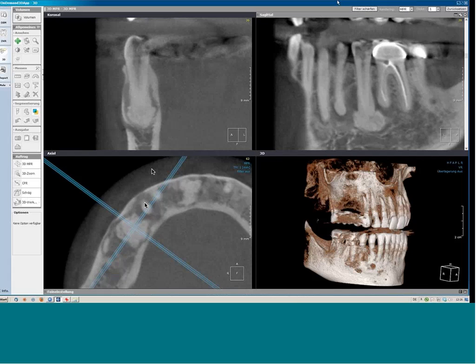And in a later stage of this pathologic change, all this hypodense material, which is hypodense due to the fibroblasts inside, is remodeled into cementous material, which you can see here around this premolar, but around here you can still see the fibroblastic change. So all these teeth are vital. There's no change in the teeth. There's no problem, no pain. The patient has no pathologic sensation.